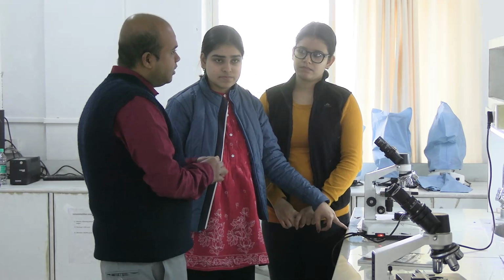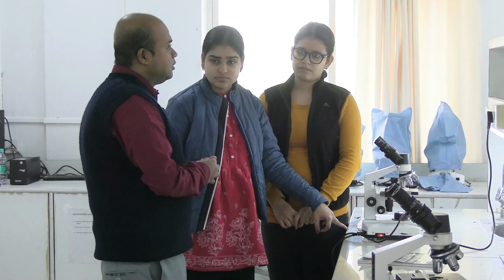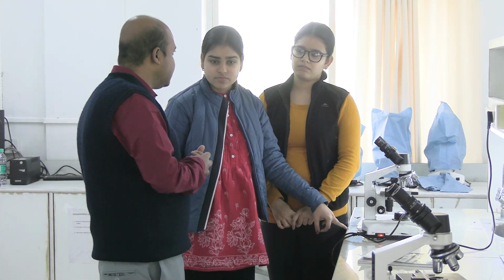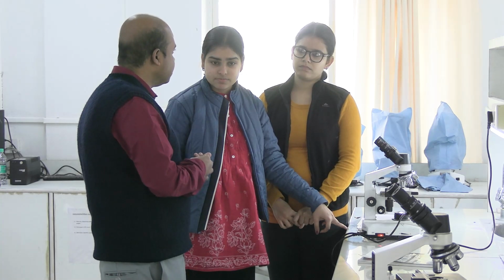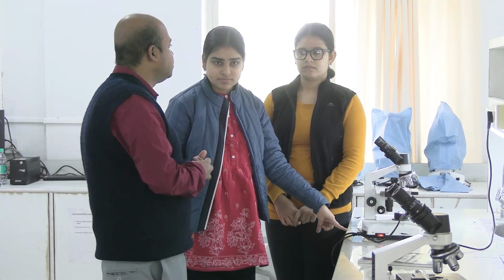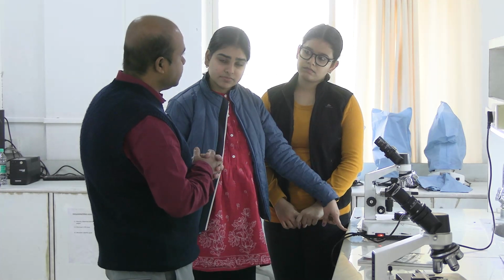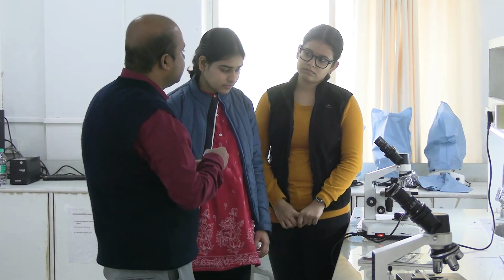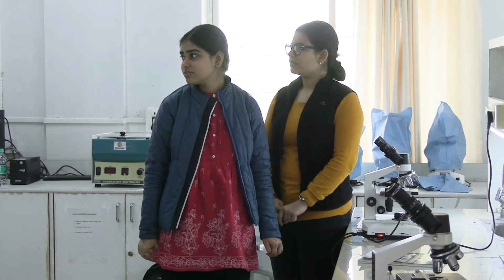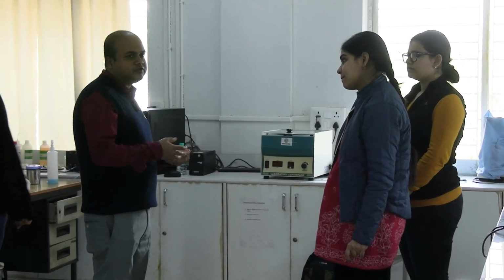Mathematics remains the same. If you can count, you are considering it 200 dilution, but actually maybe it is just 50 dilution. If you take more blood and less diluting fluid, then the dilution factor will come down. Mathematically it will remain similar, but it is not actually possible to count cells like this. So taking 0.5, taking fluid up to the required amount, mixing it, all these steps are important. Exactly 0.5 should be taken. If instead of 0.5 it is 0.8 or 0.9 of blood, the dilution factor comes down.